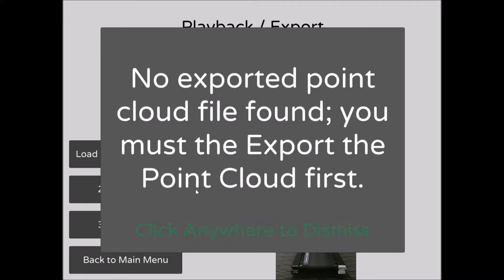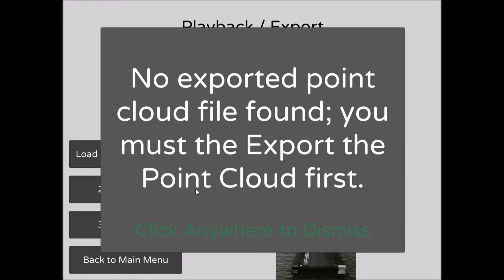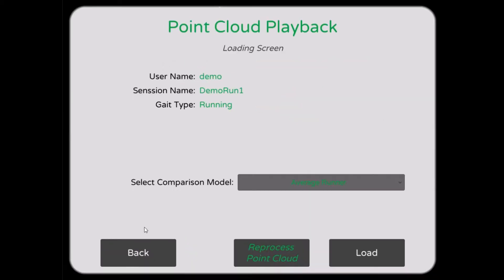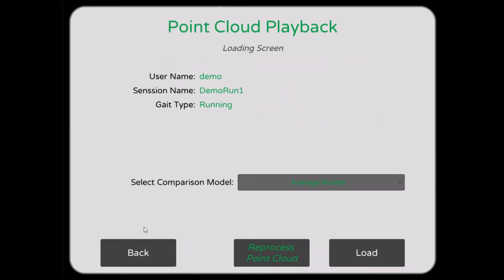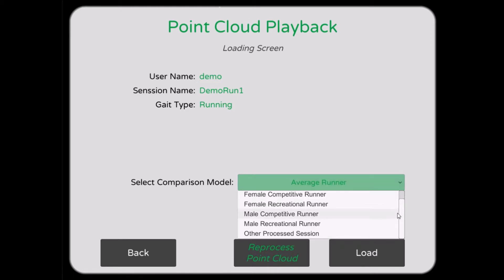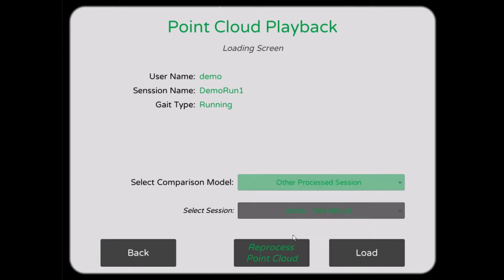3D Playback will allow you to review the 3D data from the camera. Processing new trials takes approximately 5 minutes, while previously processed data can be viewed right away. In the loading screen, select a comparison dataset, which can either be one of the models provided in the software or a previous dataset from your subject. Press Load to open the 3D workspace.